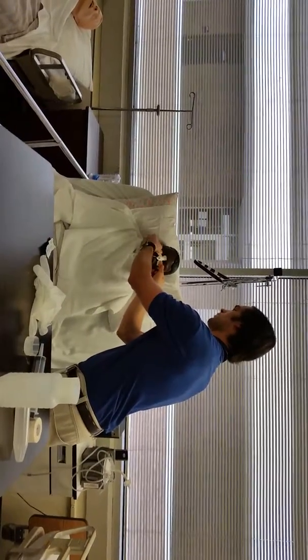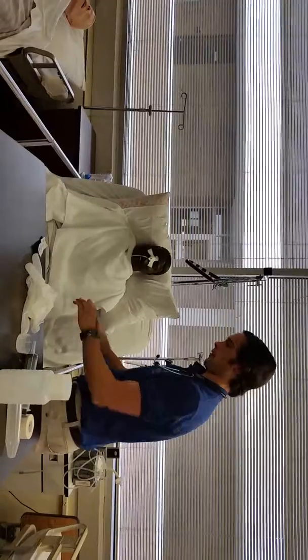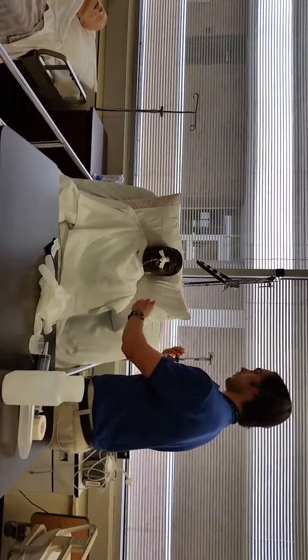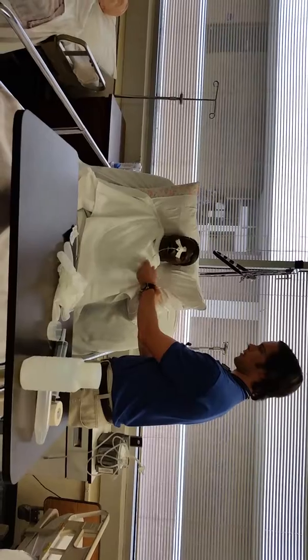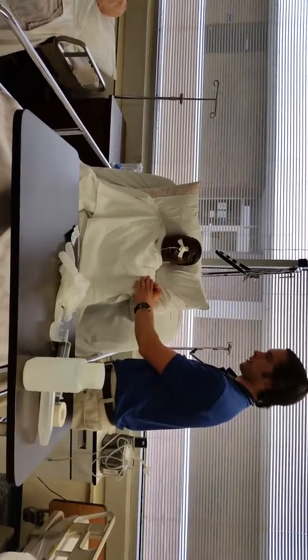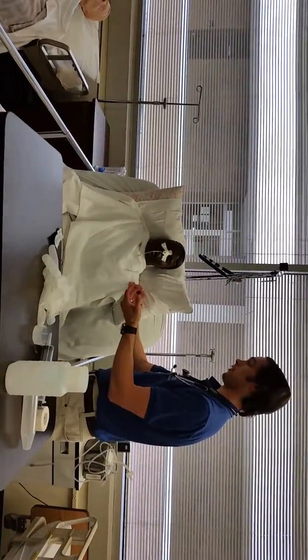I would explain to the patient, try not to pull on this, or then we'll have to place it again. Like that. Then I would take a rubber band and a safety pin, and I would pin it to their gown with enough room so they can move their head, and they're not pulling it out with their hands, and they can do their activities of daily life in the hospital.